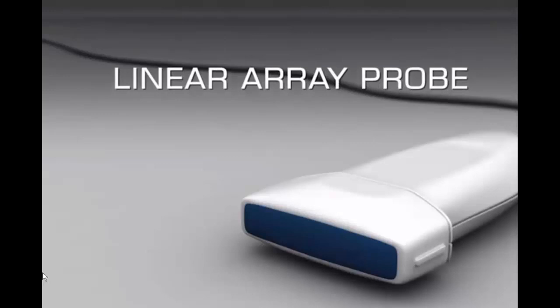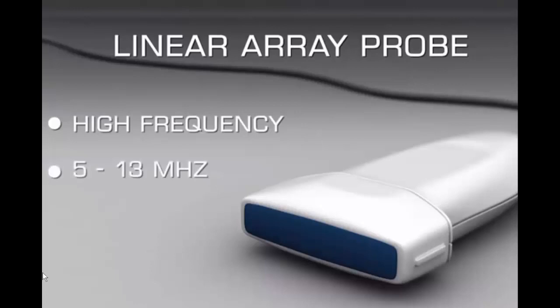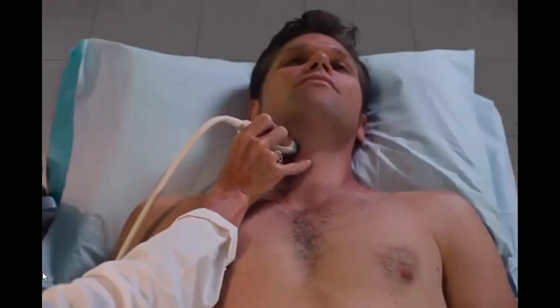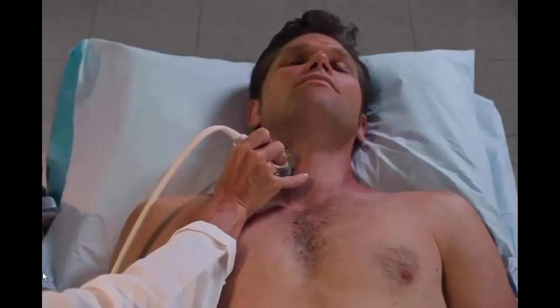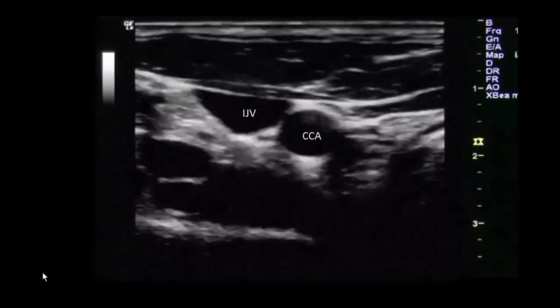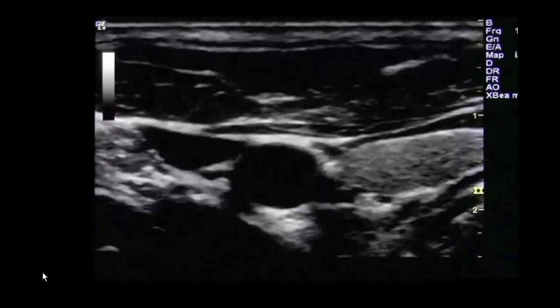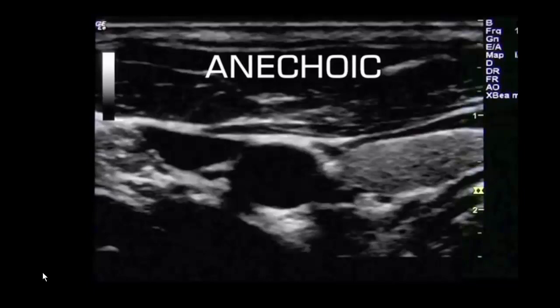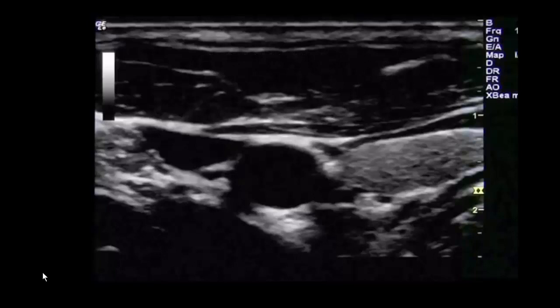A high frequency linear array probe with a range of 5 to 13 megahertz is suitable for scanning the deep vessels of the neck and the thyroid gland. Select the carotid preset on the ultrasound device. Place the probe over the area of the right common carotid artery and internal jugular vein. For the transverse view, the probe marker should be facing the patient's right. The common carotid artery will appear circular and pulsatile. Adjust the position of the probe so that the carotid artery appears in the center of the screen.